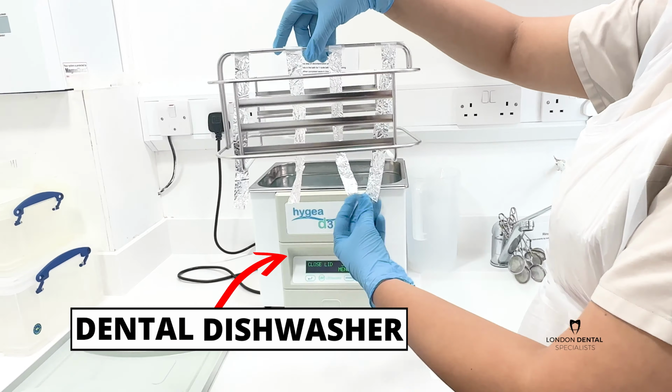And that means that Ghislaine doesn't have to manually clean the instruments the way some of us would manually clean our plates before putting them in the dishwasher at home. The only other thing that needs to be removed from the instruments are bacteria.